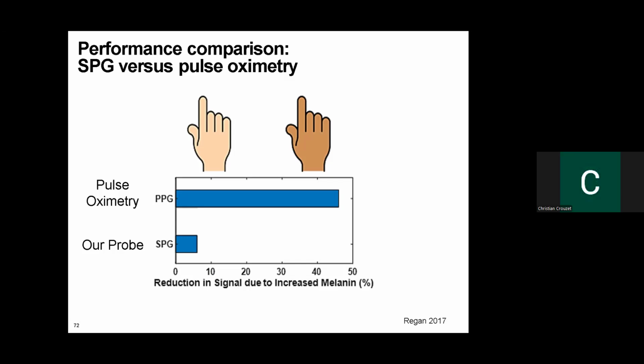This was modeling work, and it was actually shown in vivo by the founders of the finger clip based device, and they had an indirect observation that this is occurring and that the SPG is much more resilient to the effects of skin pigmentation.